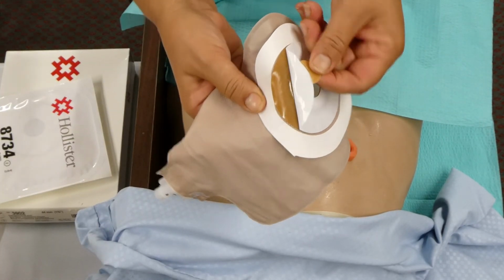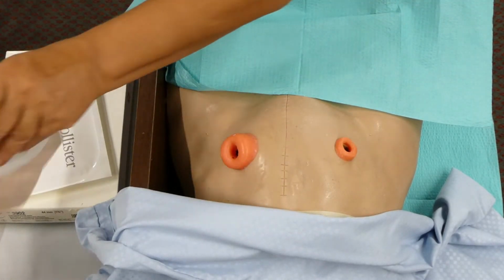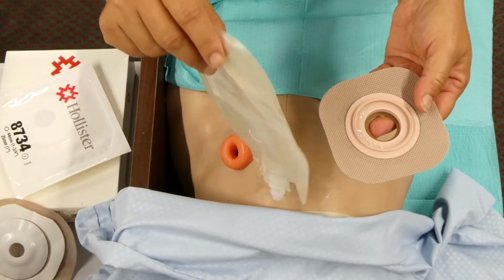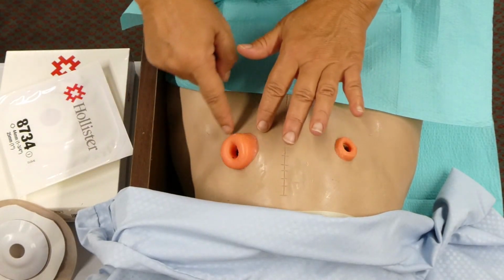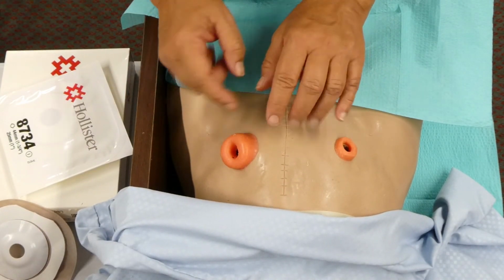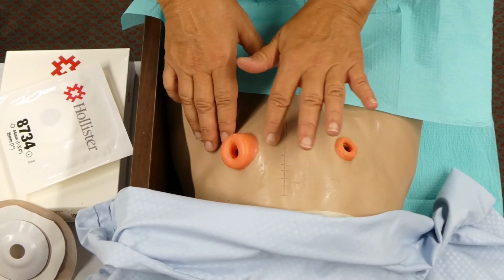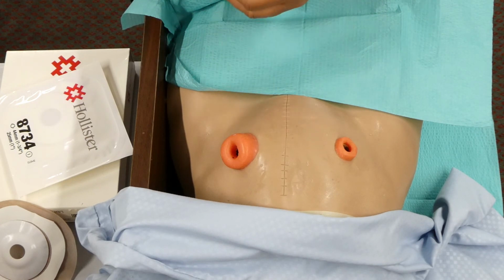Okay, here's an example of an all-in-one. And then this is an example of a two-piece. Okay. You have to be, again, very careful on the size that you cut it out for, to make sure it fits very nicely so you don't have extra skin exposed because it'll get raw and you could end up with a bad skin ulcer.